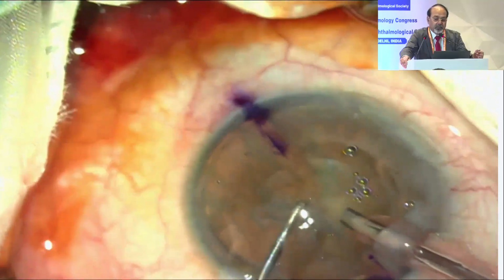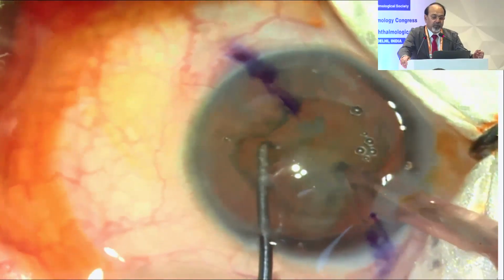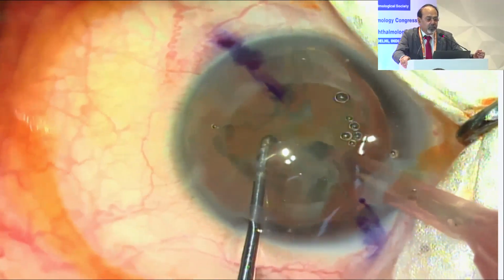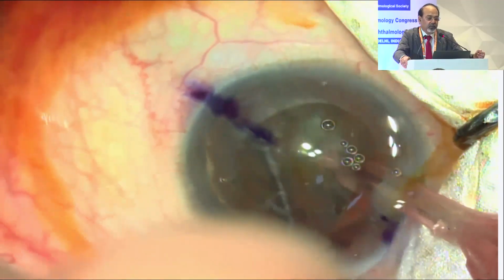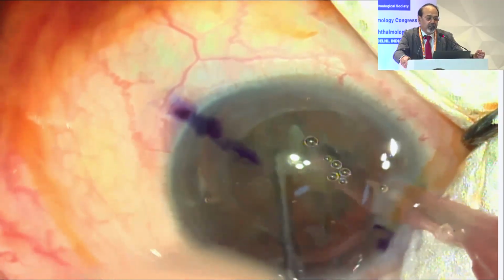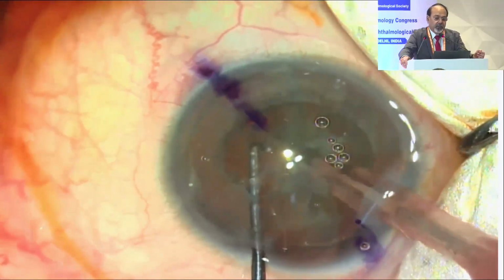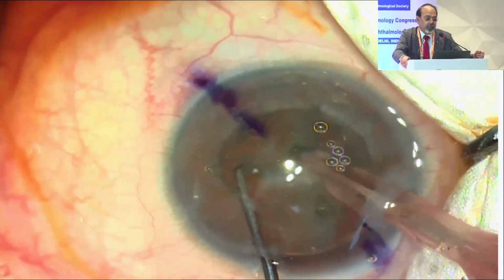It is already separated, as you can see, and then simple phacoemulsification. I do not normally do capsulotomy or capsular fragmentation with the femto laser, because I find that it sometimes goes deeper than what you expect, and that's not a very good idea. So I chop the lens myself.